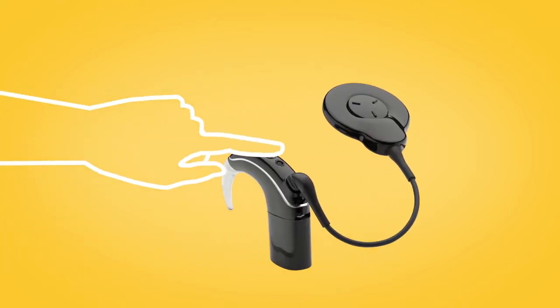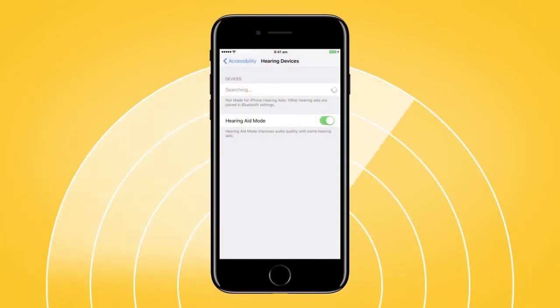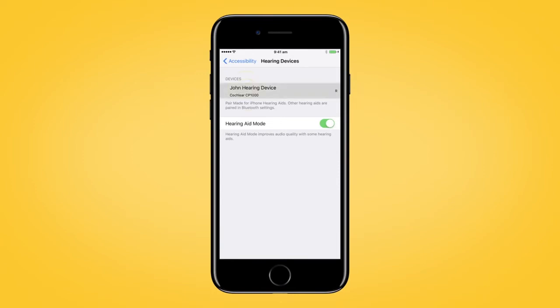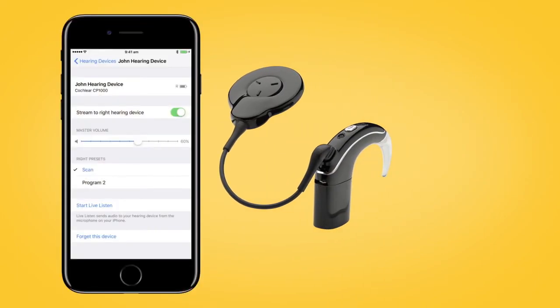Next, turn your sound processor off and back on again. Your Apple device will then search for your processor and display it here in the Devices section. Select the name of your processor and tap Pair.